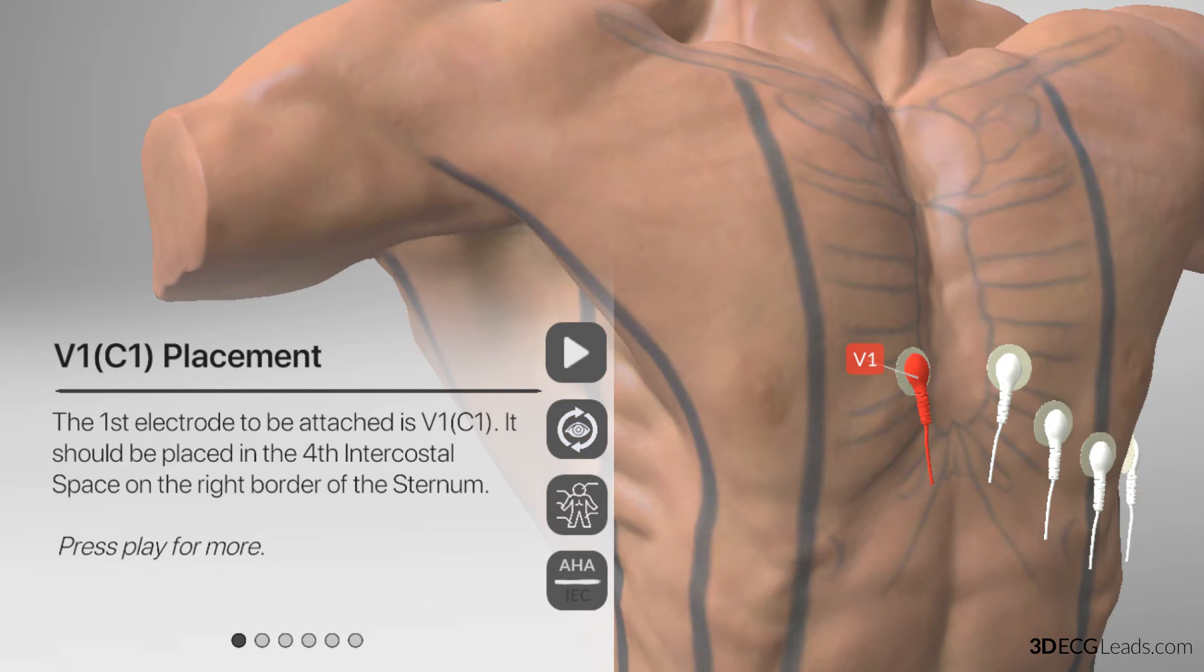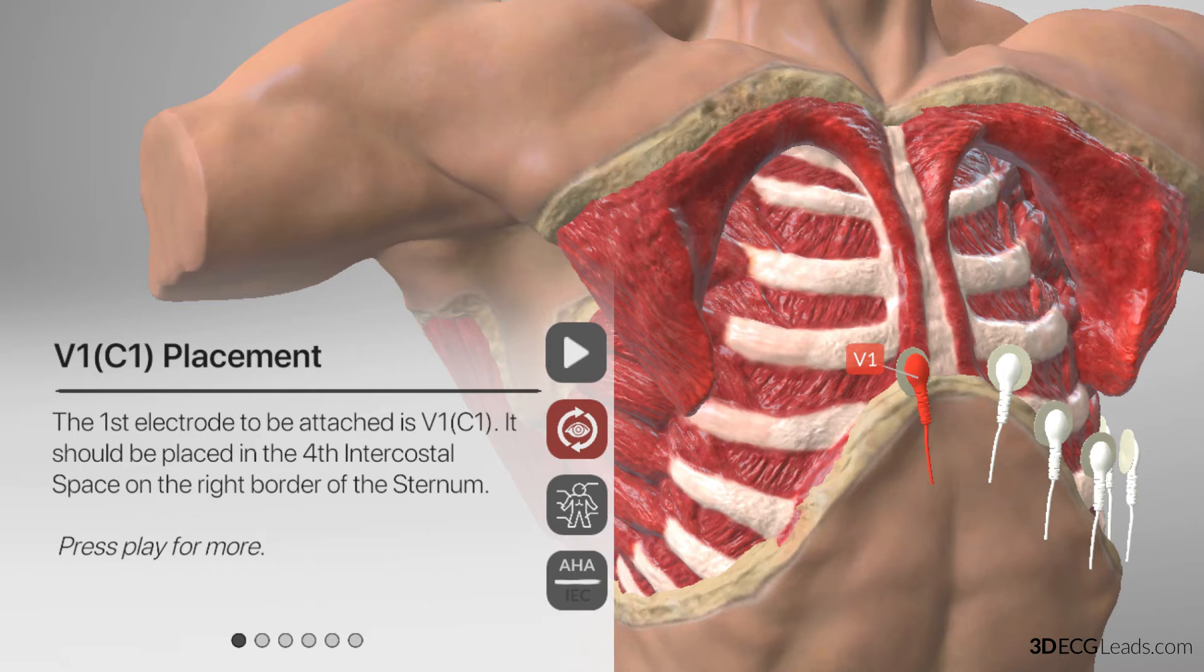If we place V1 directly in the fourth intercostal space, there is a strong possibility of misplacement. So we should do a workaround that will start from the top of the sternum. To see the workaround demonstration, press the play button.